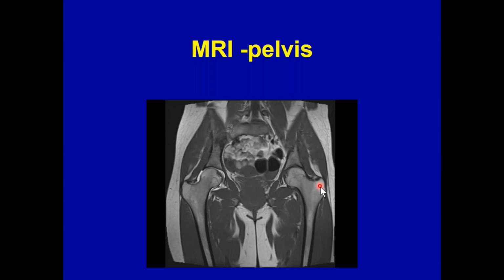So x-rays is a starting point, and this should be of importance to you female patients, if you have issues or a history with uterine fibroids as an example. This is particularly valuable. And I know some of you have had MRI examinations done, and I probably should have shown you an example of a mammogram because that's part of your routine.